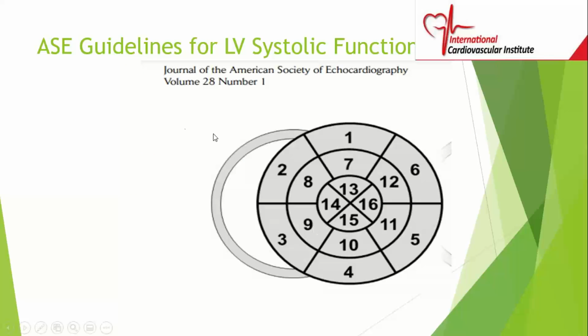And so this is our 16 segment model. This is what we call a polar plot. We essentially combine everything in one diagram. Those of you who didn't have the background information on segmentation or regional wall motion need to look at the original lectures that we gave to have an understanding. But this is what we call a polar plot, where we combine everything.